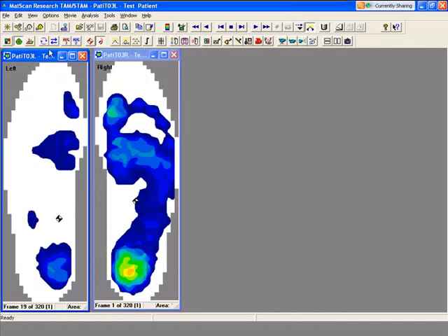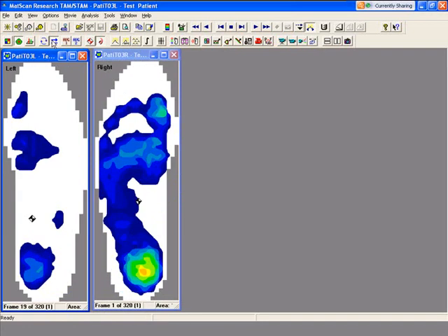When we click on the flip icon, this would be more like if you were looking up at the feet, basically if they're standing on a glass box and you were able to look up. That's what the flip column does—it reverses the view of the foot.